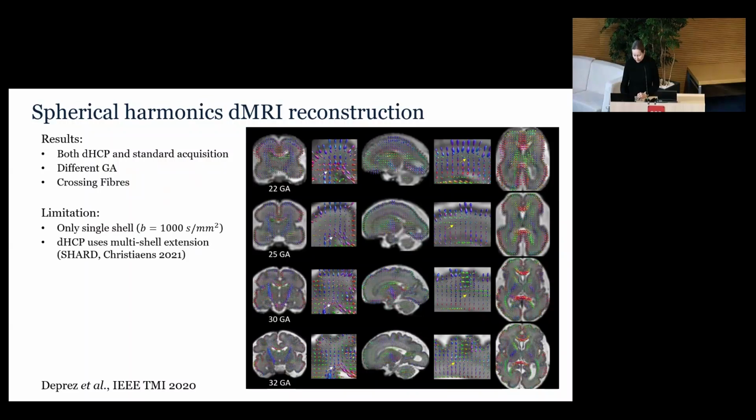Then limitations. The technique that I presented is a single shell technique. For DHCP, we have a multi-shell extension that is called SHARD that you maybe heard about. And if you are interested in my software, it's all available. You can email me for support.